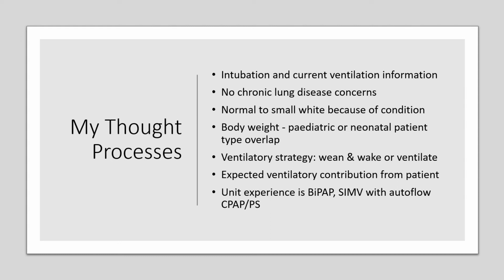So you look at what's your oxygenation, what's your end tidal doing before you then get a gas. You see what tidal volumes are being generated on the ventilator or what pressures are being generated, depending on whether you started volume or pressure mode. Then you need to look at the body weight. So this is a 5 kilo child. So 5 kilo children can either be ventilated in neonatal mode or in paediatric mode. There's no real advantage to one over the other.